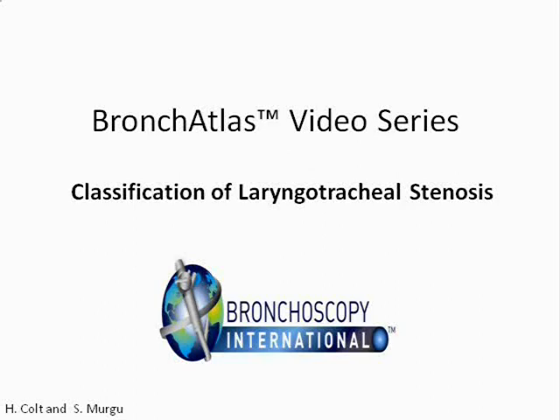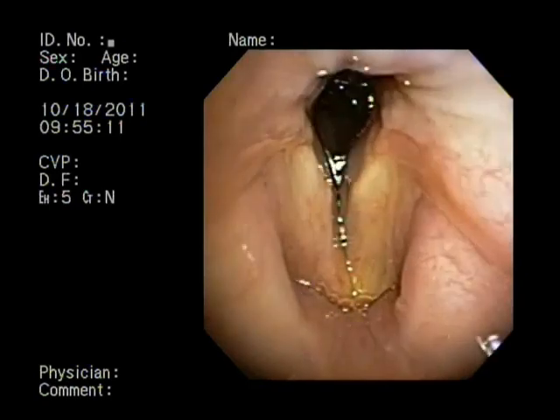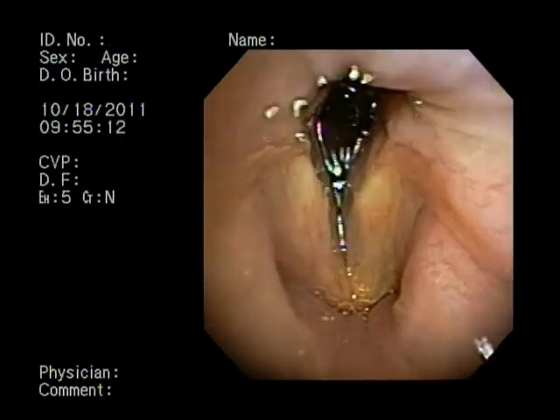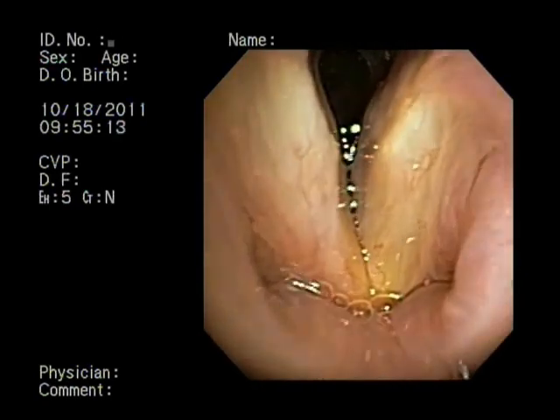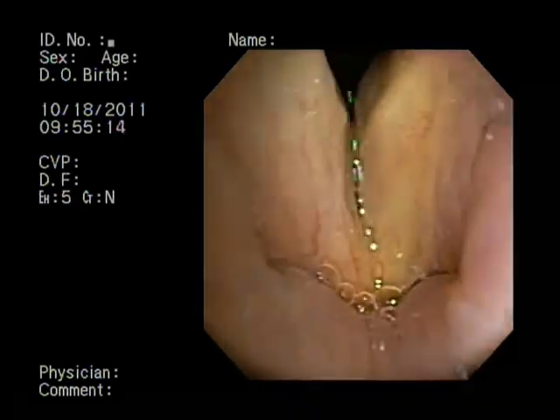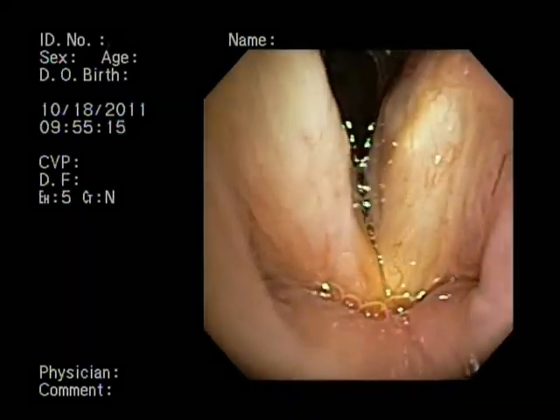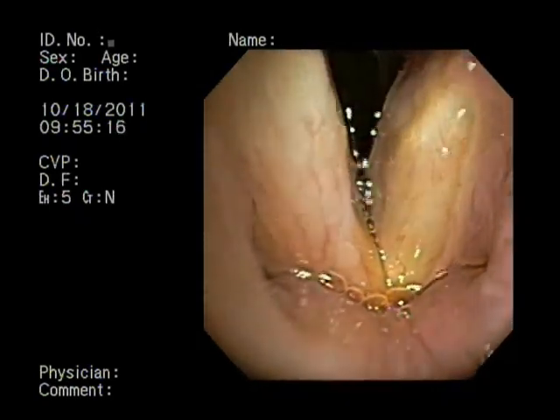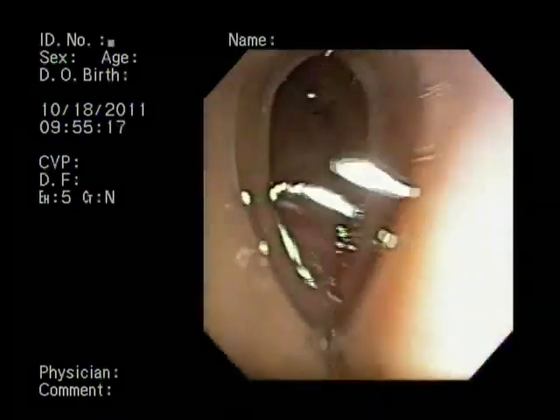Using three classification systems, this first stricture is classified as Meyer Cotton 4, McEffrey 3, and Lano 2.